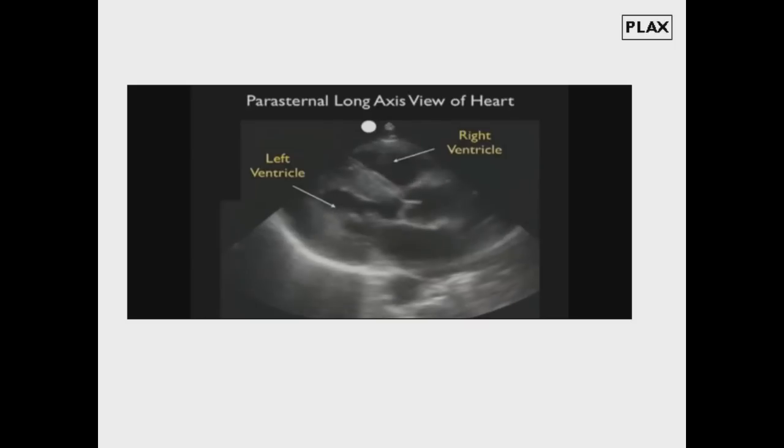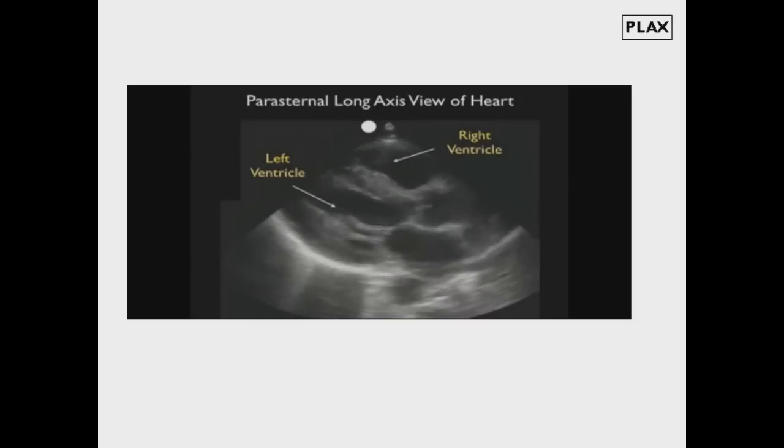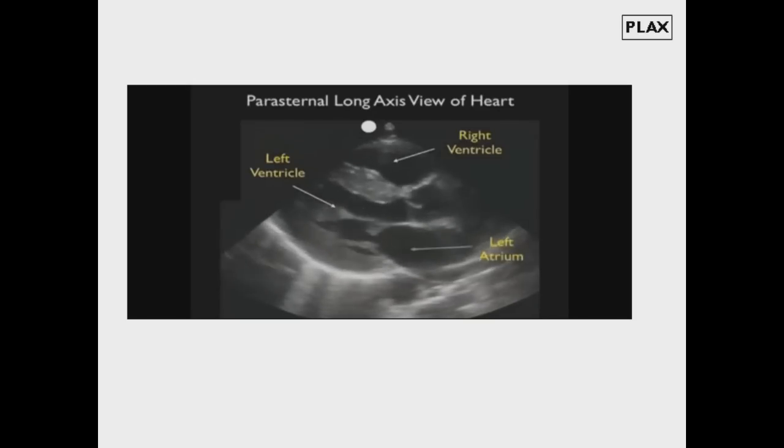We see the left ventricle posterior to the right ventricle. Note its hypertrophic walls. This patient actually had long-standing hypertension. Let's look at the percentage change from diastole through systole, and here we see that the walls come in well with each heartbeat, indicating good contractility.